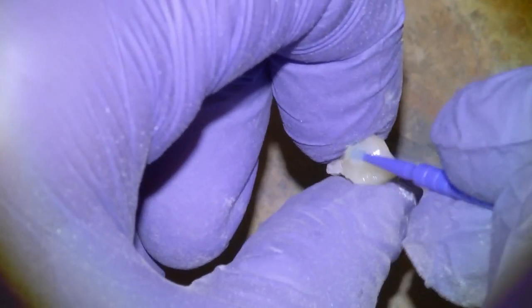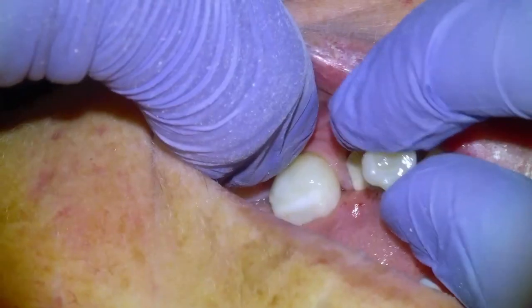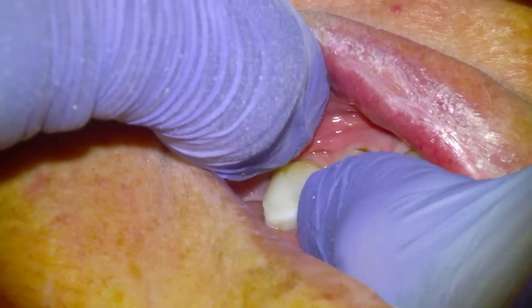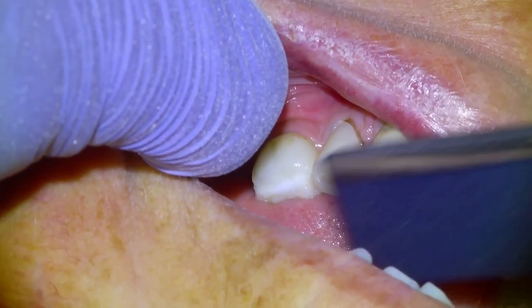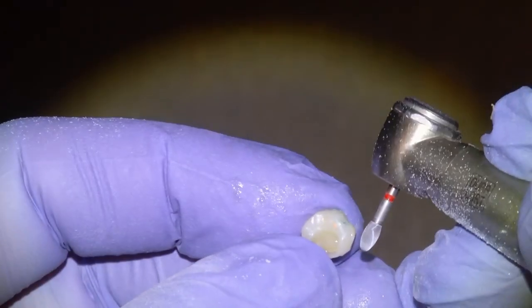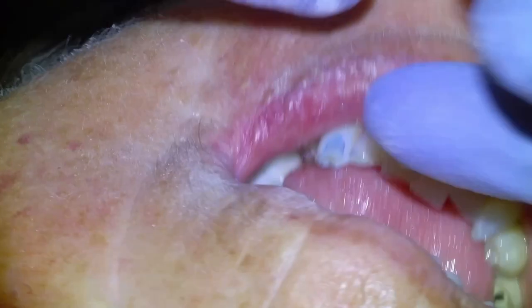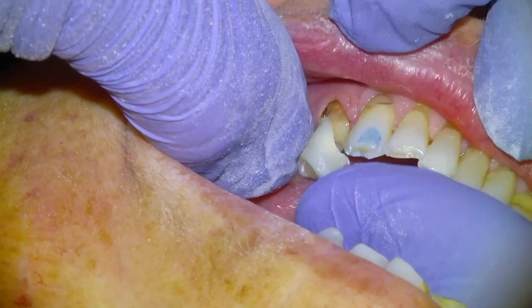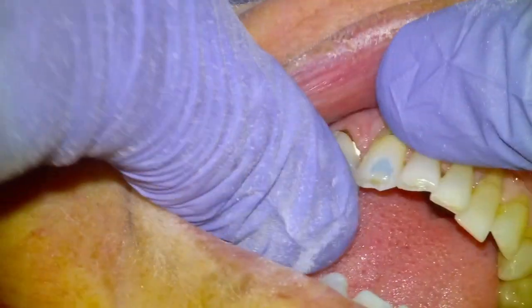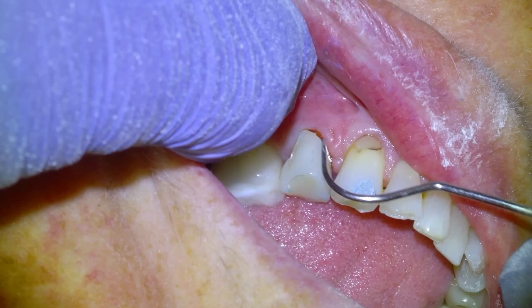I learned from Dentaltown — somebody was saying how do you polish your temps — and someone just commented that you add some bond and cure it and then it's totally smooth, so that's what I've been doing. I ended up with a void so I patched it with some flowable composite. We'll check the bite and take everything out so there's no contact on the temp, then cement it with our temp bond, clean up the temp cement, and that's it for this appointment. We'll get the patient back next week to cement the crown.